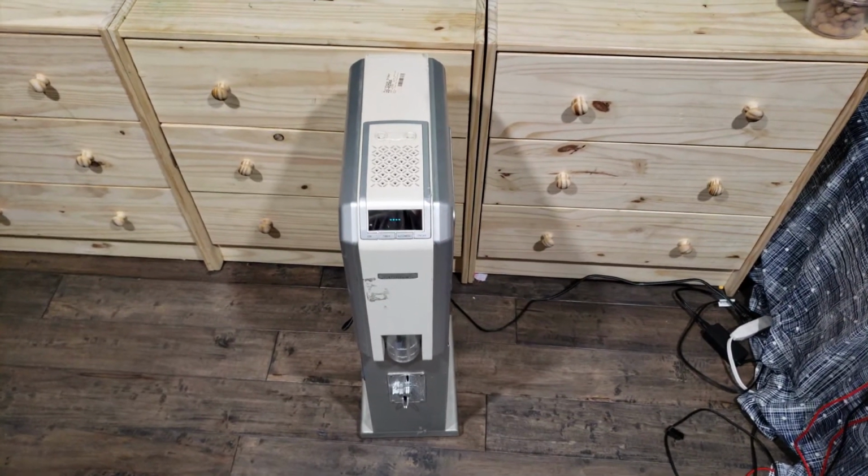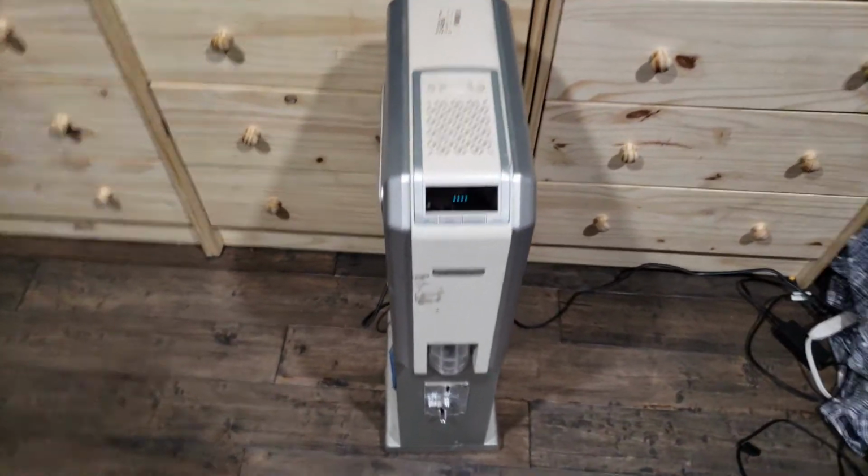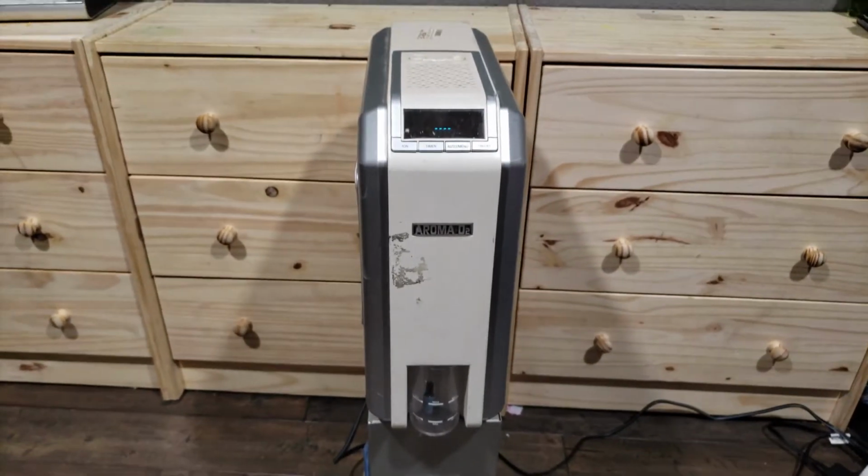So today we're going to take a look at this little bit of medical quackery, AromaO2. We're going to take it apart, see if it does anything.